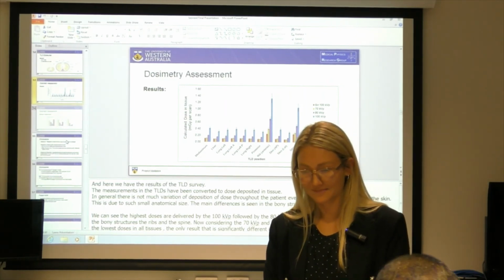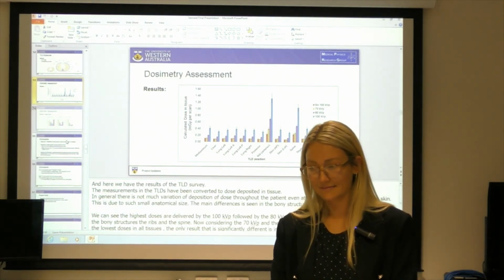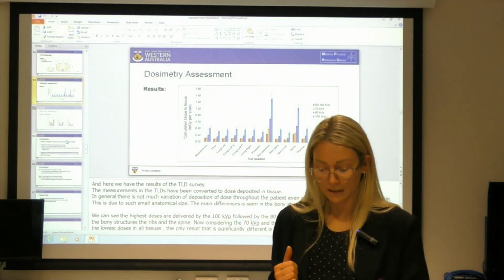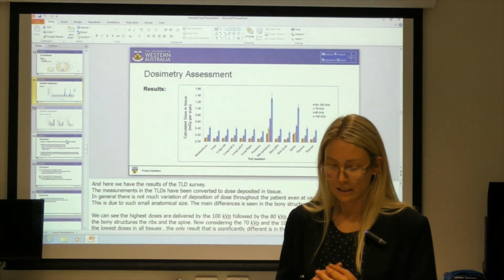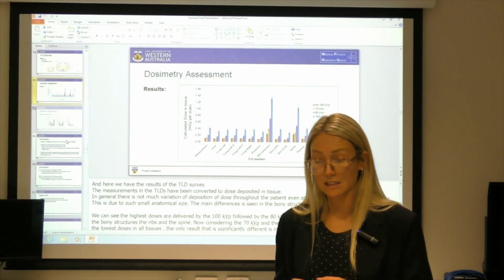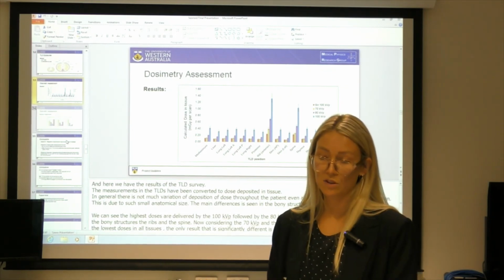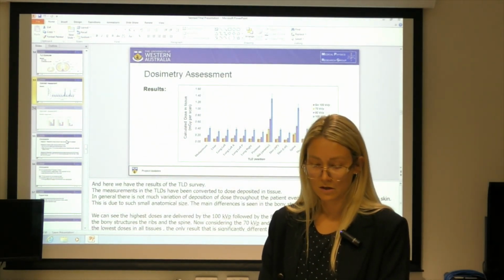Just quickly. Brendan, how did you measure your CTDI to match your CTDI for image quality assessment? For the image quality assessment, I just used the displayed value of the CTDI from the scanner, but a separate part of my project was validating that CTDI. So I did the traditional method of using a pencil ionization chamber to measure the CTDI, and I compared it to the displayed value on the unit so that I could trust the value that was displayed on the unit, just to use that for the image quality assessment. Does that answer your question? Yep. Thank you very much.